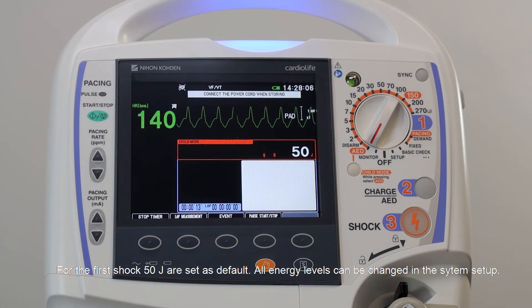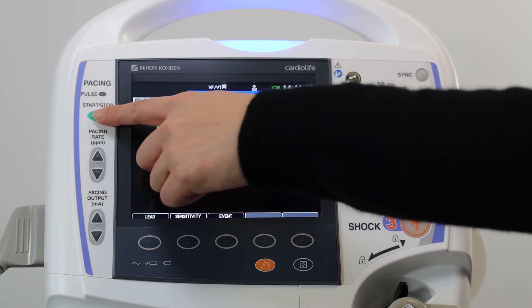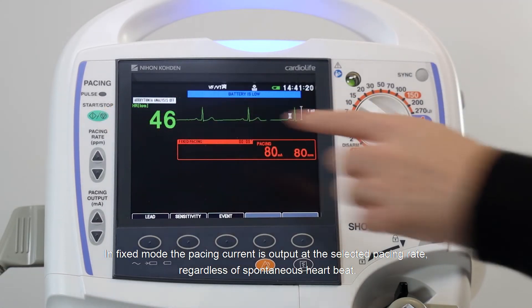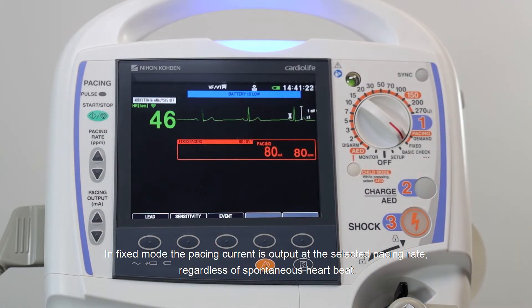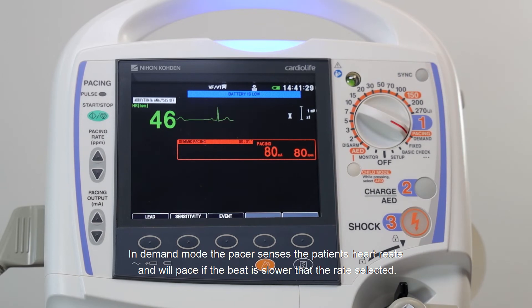Patients with bradycardia can be paced with two modes: fixed and demand. In fixed mode, the pacing current is output at a selected pacing rate regardless of spontaneous heartbeat. In demand mode, the pacer senses the patient's heart rate and will pace if the beat is slower than the actual rate selected.